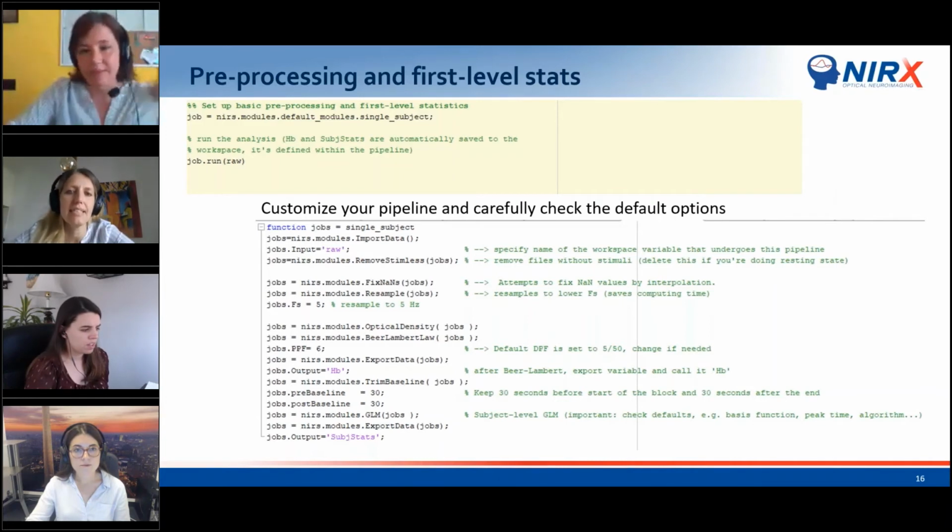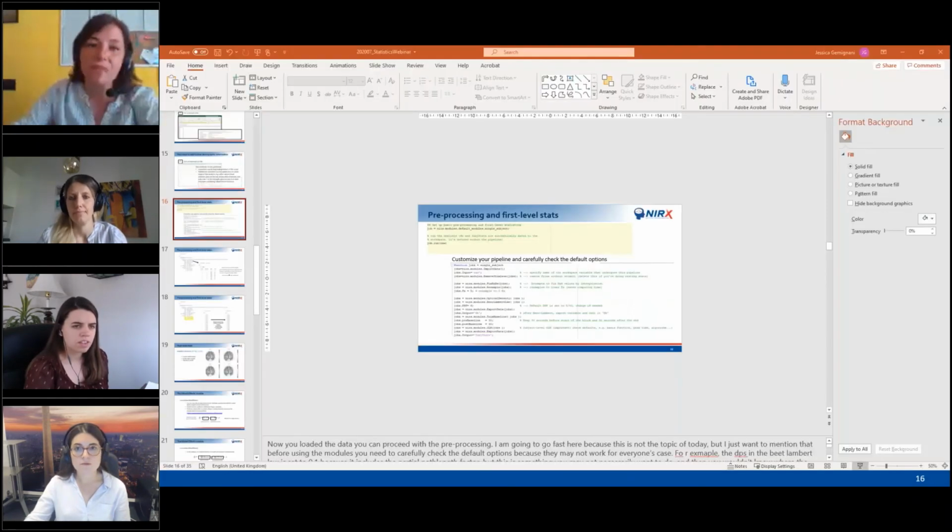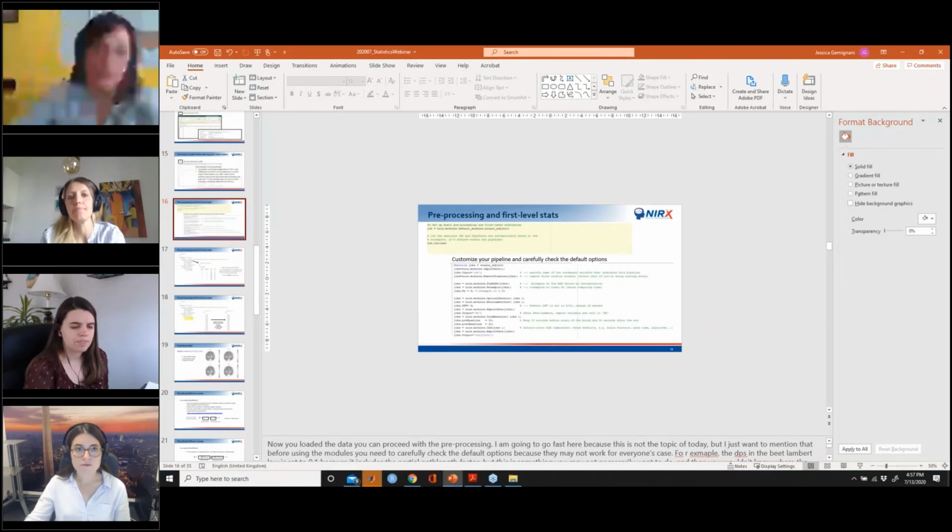Okay, that's fantastic, because it's almost never the same, and it has to be. Definitely. They need to be the same because they need to capture the concurrent variations. That's what you actually want. Okay, perfect. Next question.